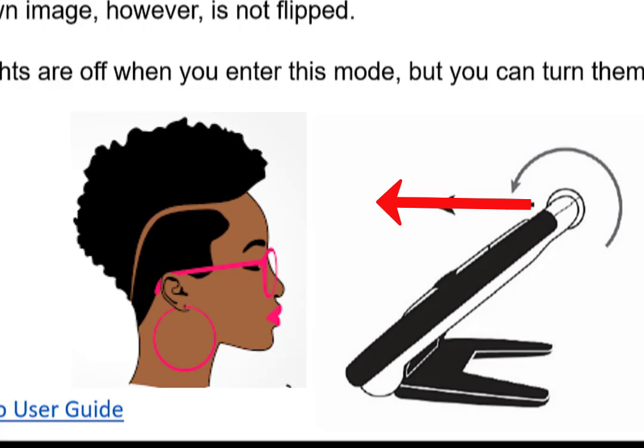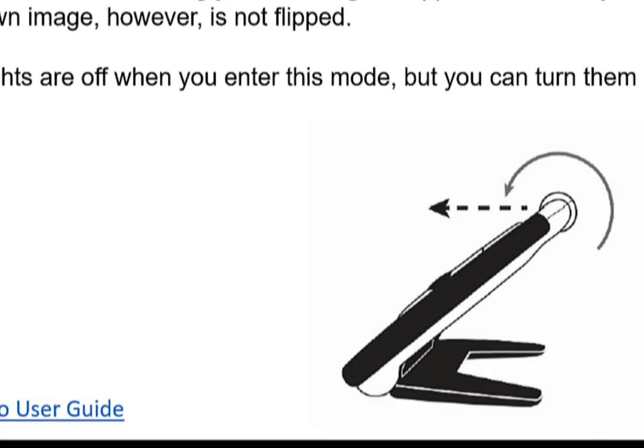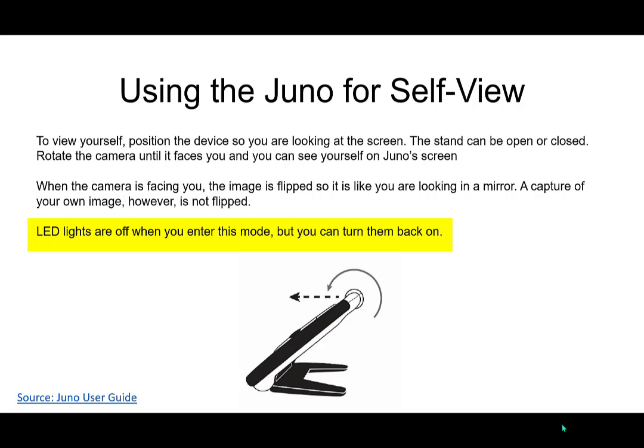So functional tasks. As an FYI, that LED light does shut off when the camera is in self-view. That's not a problem. You don't have to worry about having that light shine directly into the student's eyes. It will automatically shut off, and that's for, obviously, safety reasons.